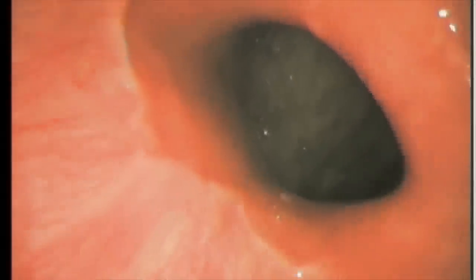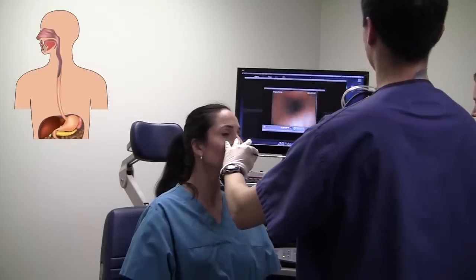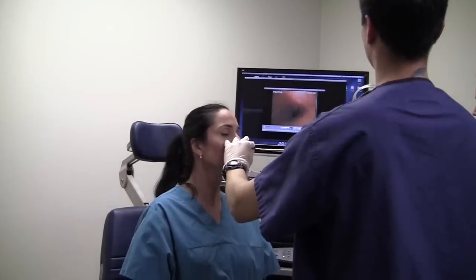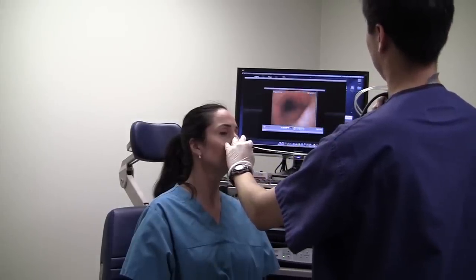Here we can see a clear border separating the esophagus from the stomach. At this point, the scope is gently withdrawn.